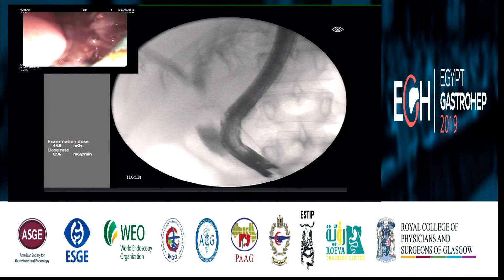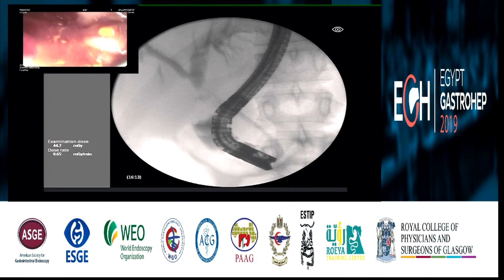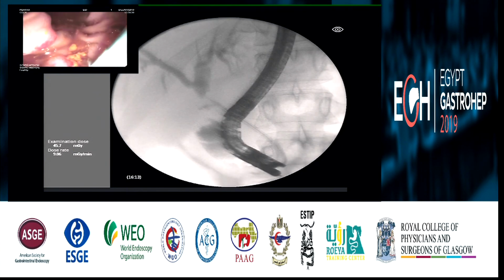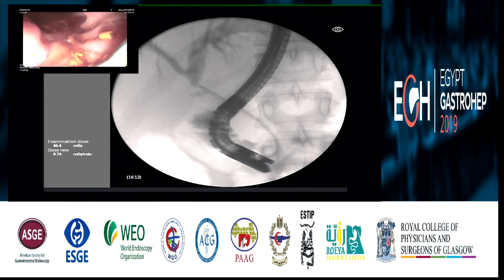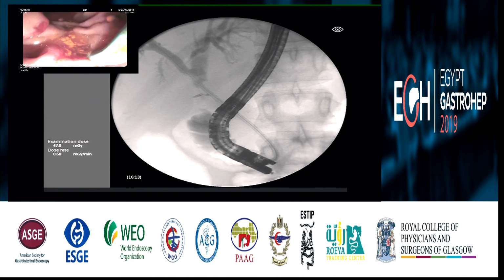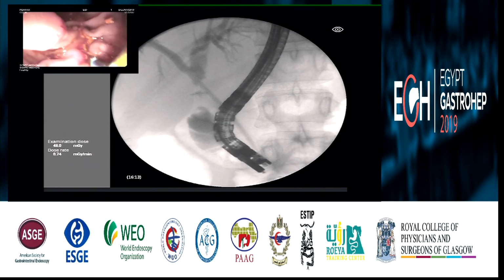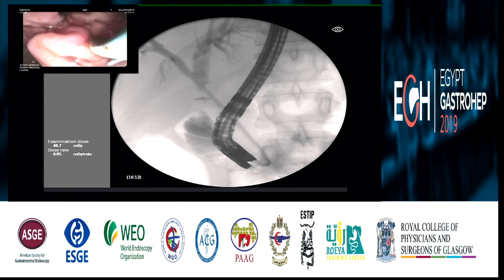So we can put two wires. But as the stricture has been balloon dilated, it's benign. In this case, it's relatively easy to get a second wire alongside the first plastic stent, and it'll probably save one exchange. Okay, thank you very much, Dr. Ivo, because now we can use the same wire for parallel cannulation of the left duct. Release.